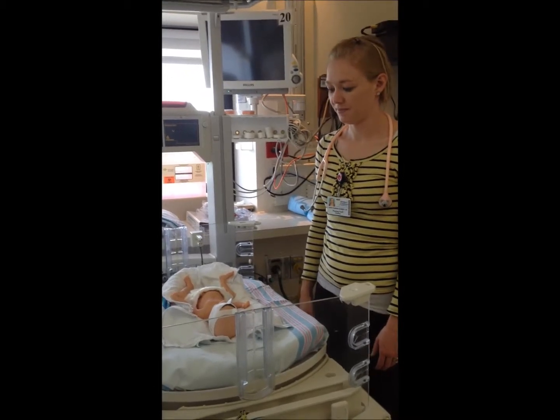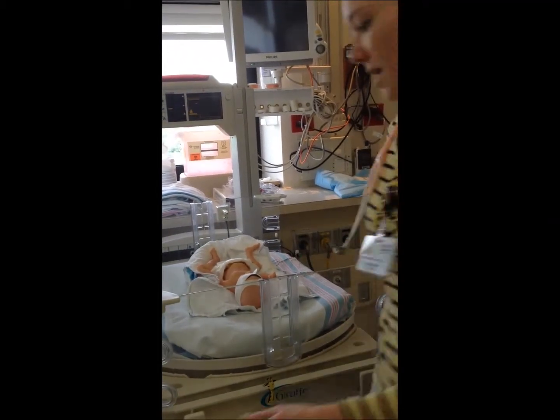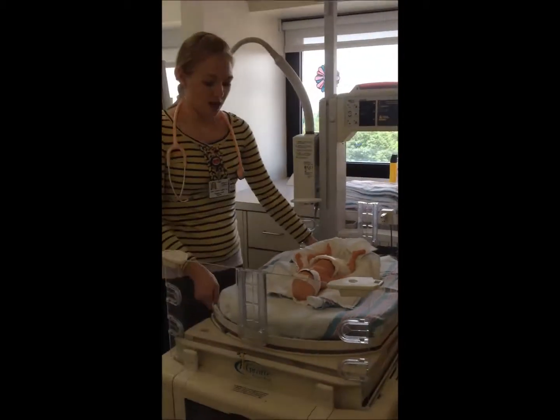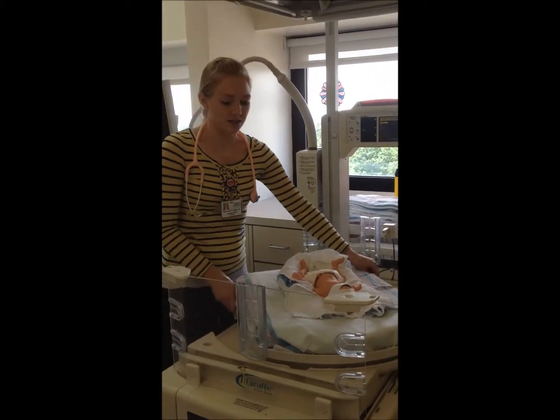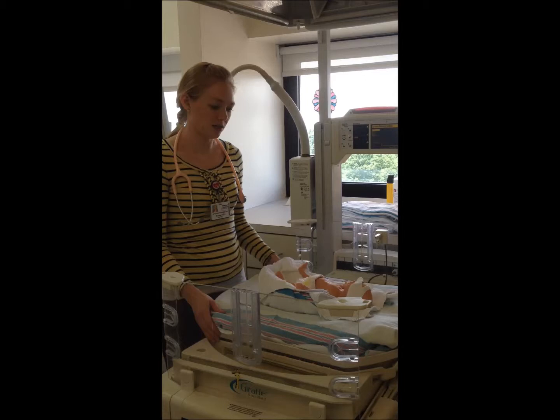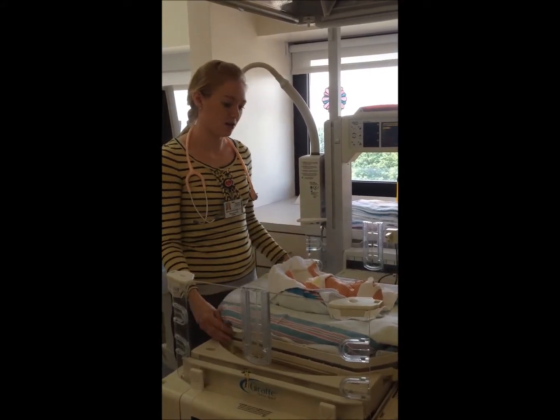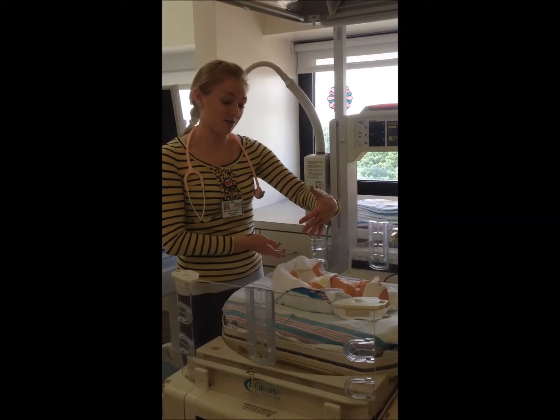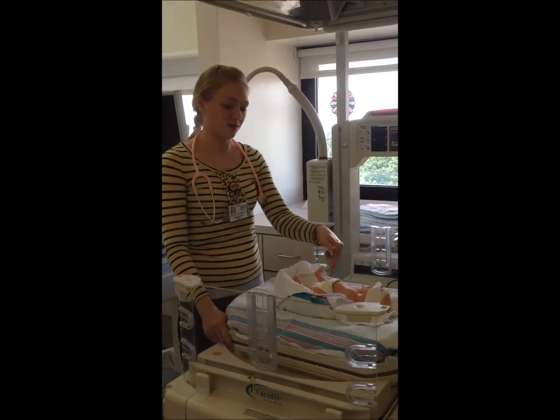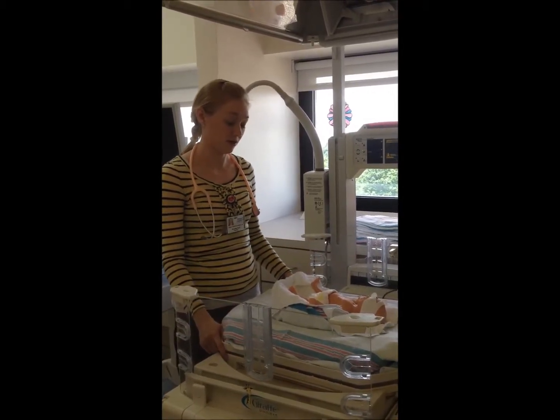Can you show us how the mattress is pulled out and the baby's able to be turned if needed? Yeah, something that's very nice about these beds is that we can turn the mattresses within the bed without having to remove the babies. And something small like this is extraordinarily helpful for these teeny little guys. Sometimes we need to access their feet or their heads, and we need to move them in order to have the right angle and the right access. Their veins are very tiny and hard to put IVs in, and it's oftentimes very tricky to turn the infant themselves on the bed. Turning the whole bed is a lot easier. They oftentimes will have lots of lines and different things connected to them, and that can be very challenging. So being able to turn the bed like this is really important.